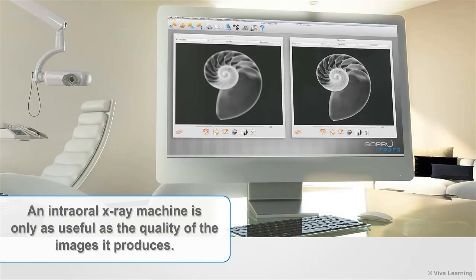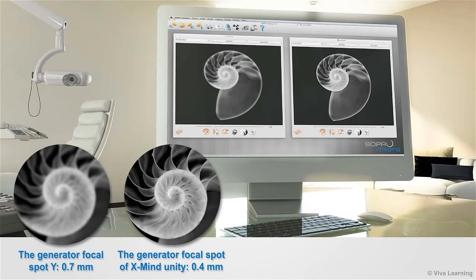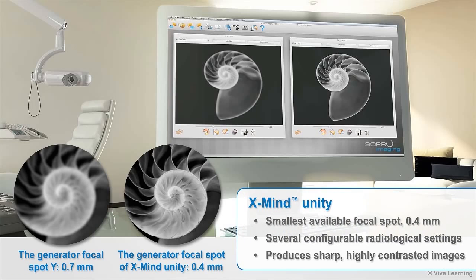An intraoral X-ray machine is only as useful as the quality of the images it produces. While most dental X-ray machines have a 0.7 mm focal spot, the XMIND Unity has the smallest available focal spot — 0.4 mm — as well as several configurable radiological settings. These parameters combine to give you sharp, highly contrasted images with very clearly defined contours for extremely reliable diagnoses.